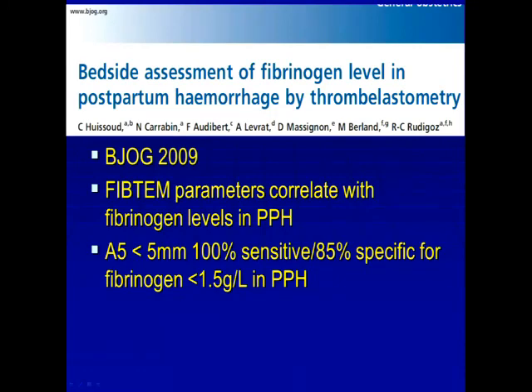But I guess the biggest clinical addition here is that the values we currently use for TXA dosing and algorithms are very fixed. It doesn't matter what size patient you are, or what the individual physiology is. It's sort of 1 gram up front and then a gram over 6 to 8 hours or something like that. But this allows you to determine whether this patient needs 2, 3, or 4 grams, which you can see in liver transplants on reperfusion, where they often need up to 4 or 5 grams of TXA with a previously completely normal ROTEM. So things really do change quite quickly, and you can see that in real time with ROTEM.